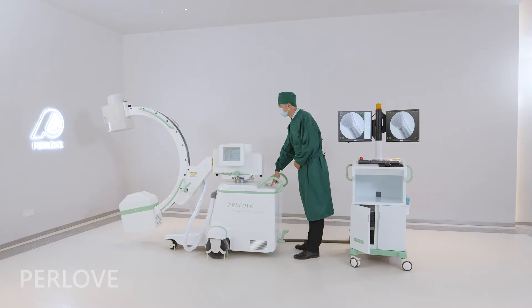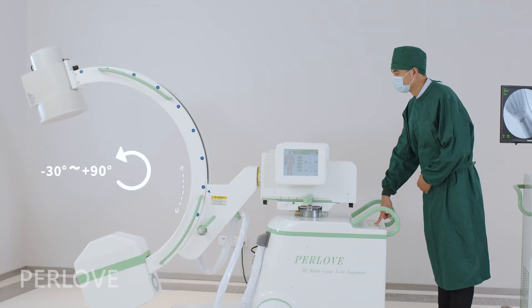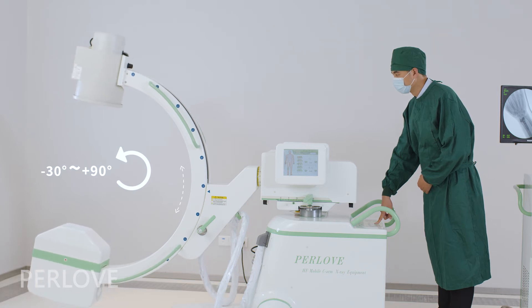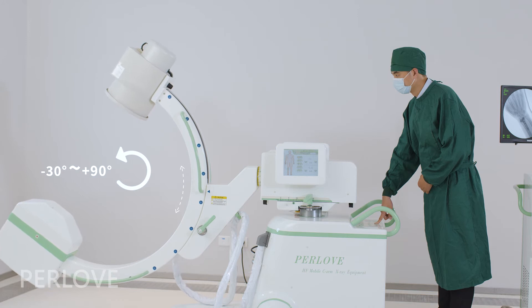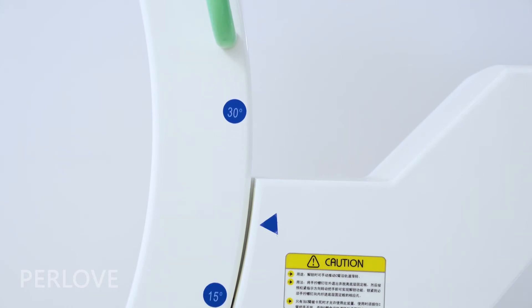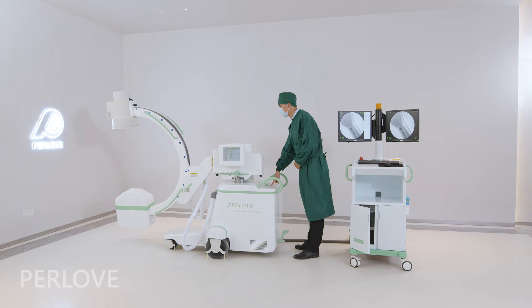Electrical rotation around the orbit ranges from minus 30 degrees to plus 90 degrees, and electrical rotation around the horizontal axis is plus or minus 180 degrees.